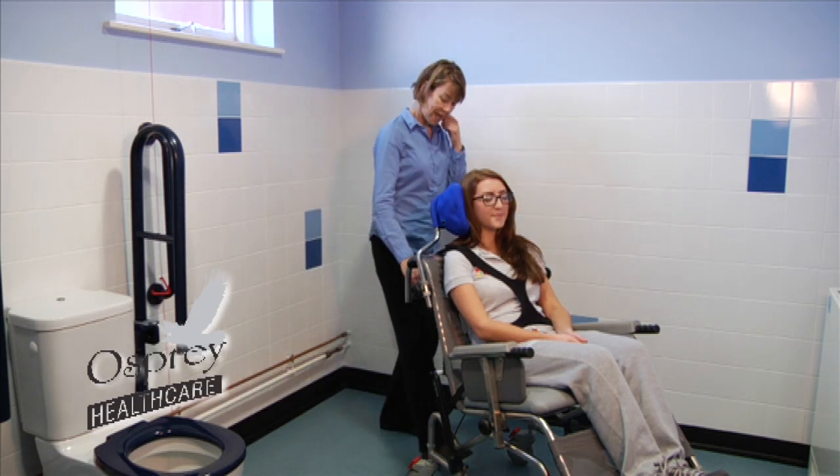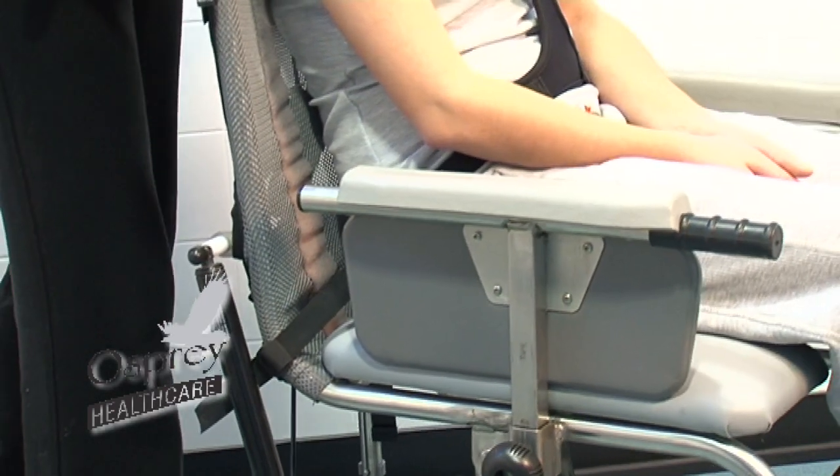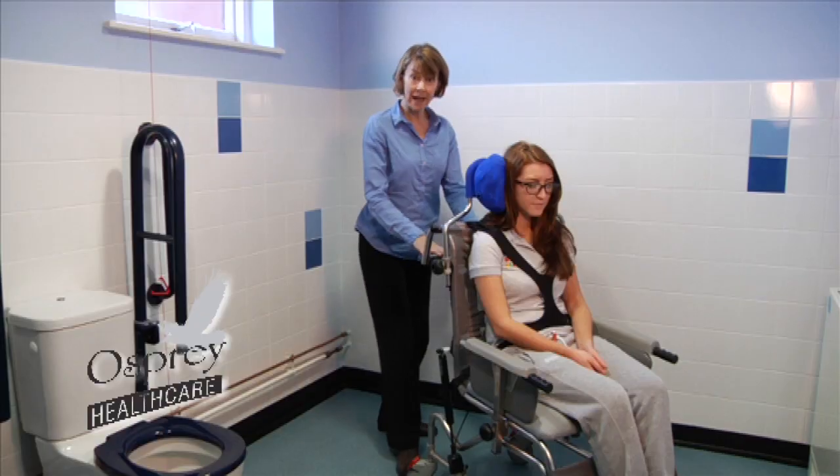To bring the person back up again, it's simply a matter of squeezing that lever, and the chair and the gas struts will bring the chair back up. Again, there's a powered version if need be.